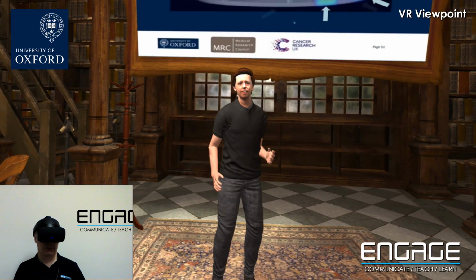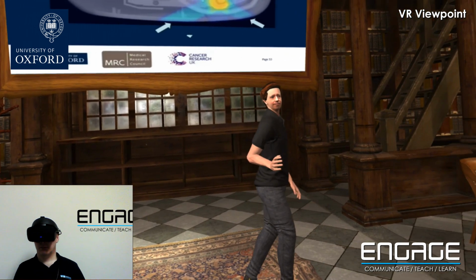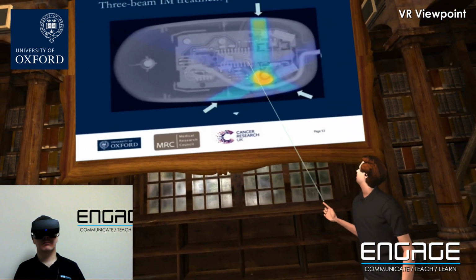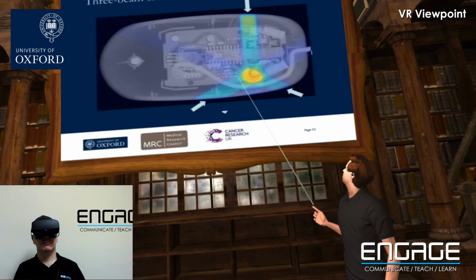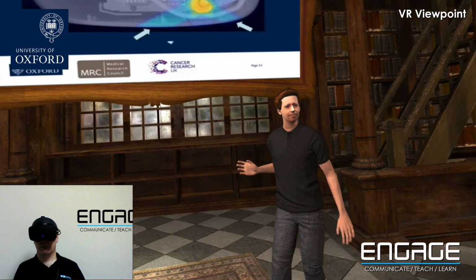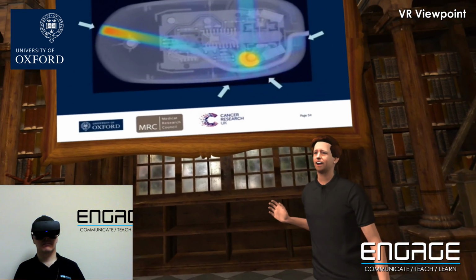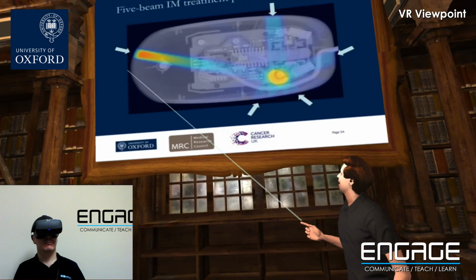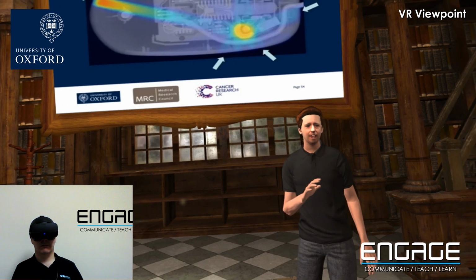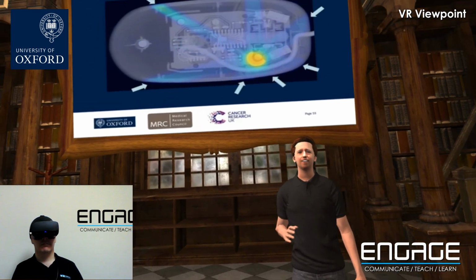Okay, well, let's change the orientation of the beams. You can see things get a little better still. Lost the yellow color from here. This blue color is pretty good. Your body's not bad at dealing with that amount of radiation. Still getting a good level of radiation into the tumor. Okay, so why settle for 3? Let's try 5. Maybe we've gone too far here. We've introduced a hot spot here now, which I don't really want to do. But let's simulate 7 and see what happens.